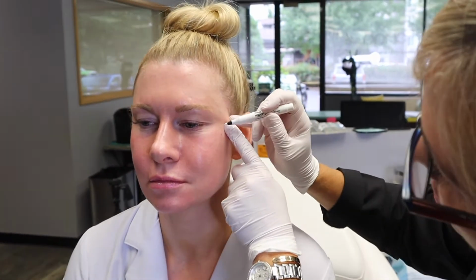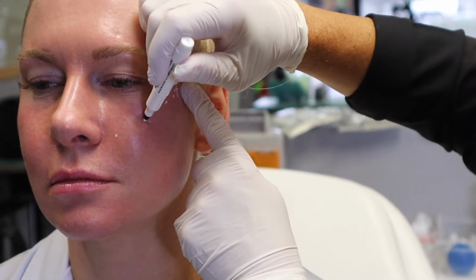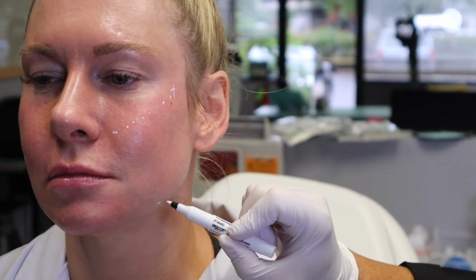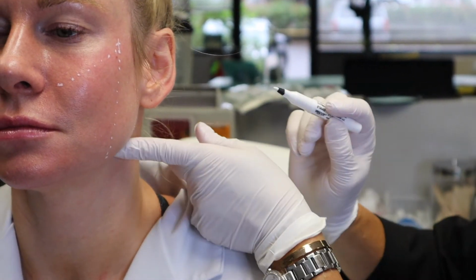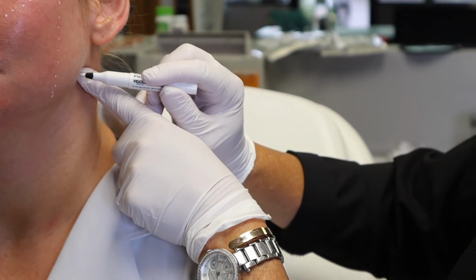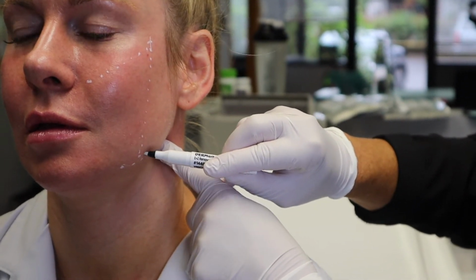The first step in the PDO treatment is to map out the area that the patient wants to focus on. So we always look at where the skin laxity is and where we want to pull the tissue from each angle, and then we draw out the trajectory of the thread. So here you see us starting at the lateral canthus and marking our spot there, and a couple threads heading over the cheek and down toward that jowly part that sometimes we get along the jawline.